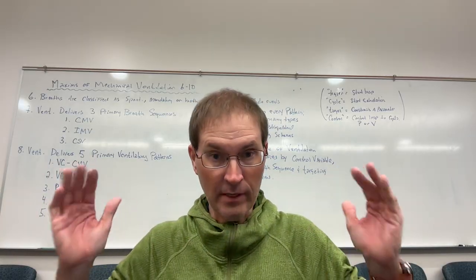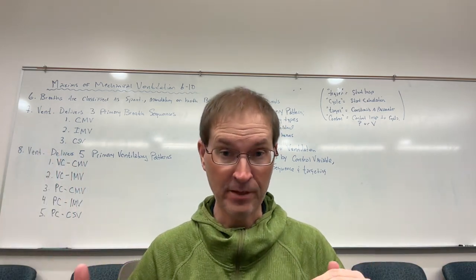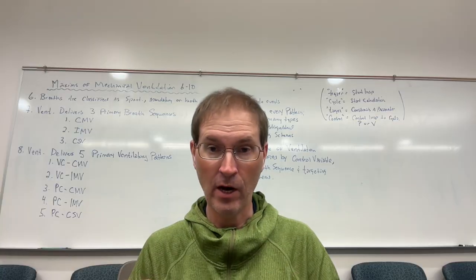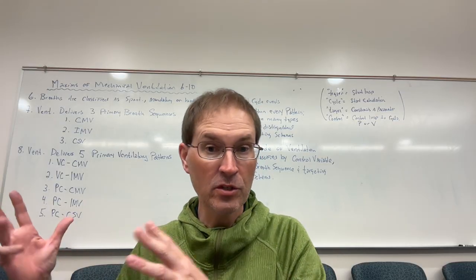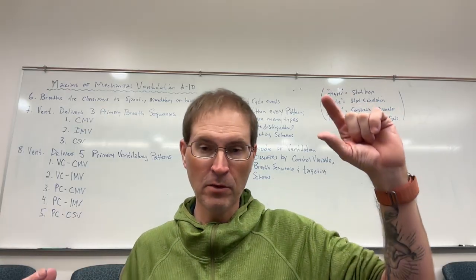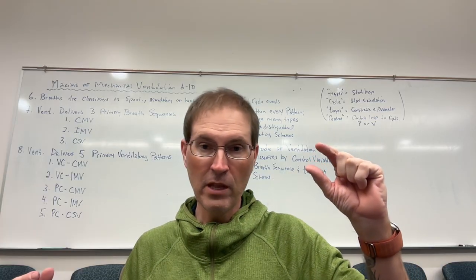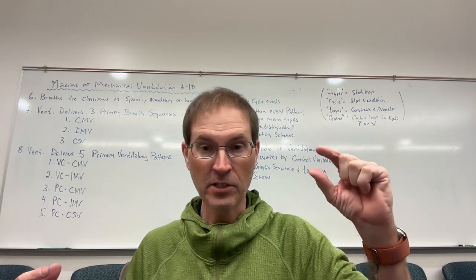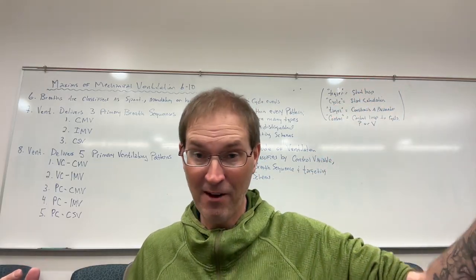And again, what we're doing is we're building the basic physiological foundation of universal shared terminology of what's going on. And then when you go back and you're interfacing with your facility's or your program's specific ventilator, and there's a mode that says super comfortable, volume limited pressure support adaptive NAVA mode number 7, okay, and that's the trademark name that company gives.